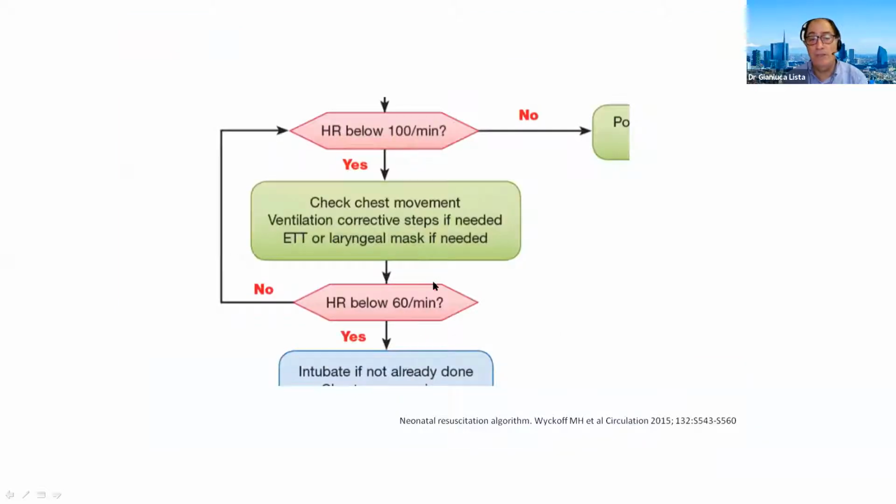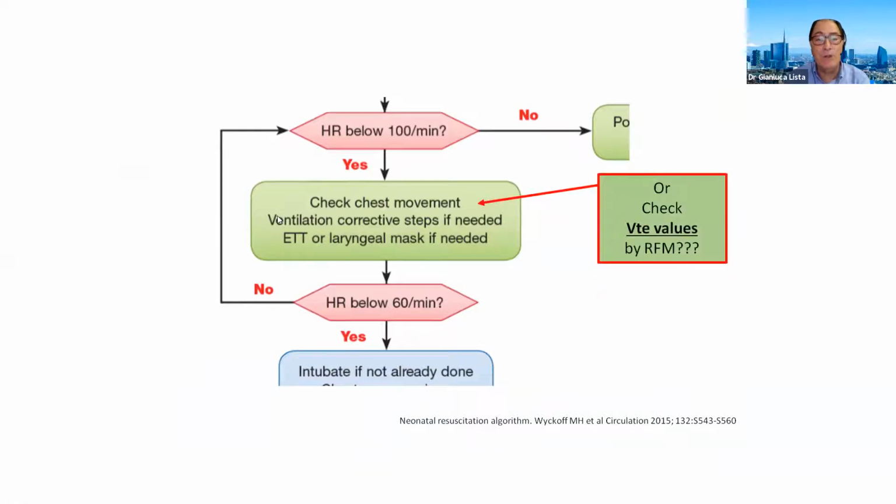We hope in the future that the reason to intubate the baby, that is, when the baby is bradycardic, is regulated not only by observing the chest movement, but by measuring in real time which tidal volume you are able to generate with your respiratory support in the delivery room.